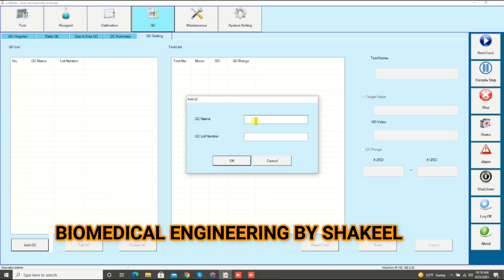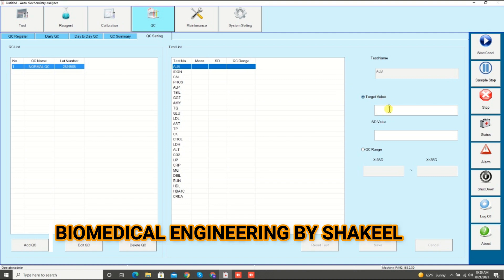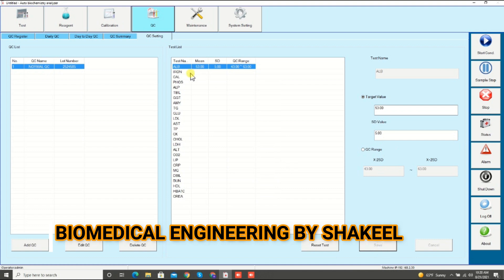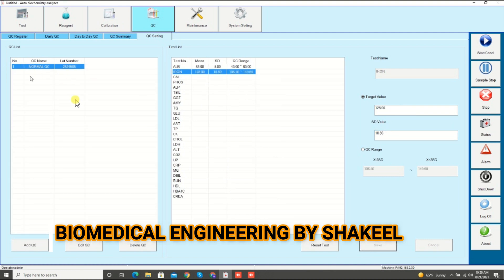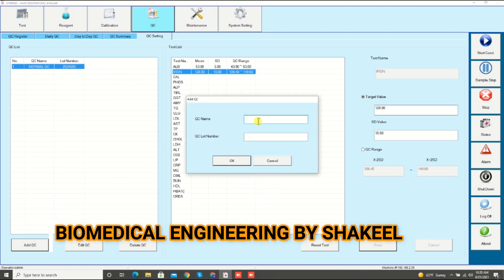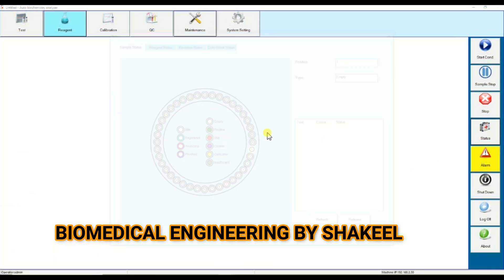Now it's time to enter the quality control values. Click on QC, then QC setting, then click add QC. Here you need to enter the QC name — for example normal control, path control, whatever it is. I am writing normal QC and QC lot number, click OK. It will show you all the parameters. Click on a parameter, for example albumin, and enter the mean value — your target value, suppose 53 — and the standard deviation value, then click save. Do the same for each parameter, for example iron: enter mean value 128, enter SD, click save.